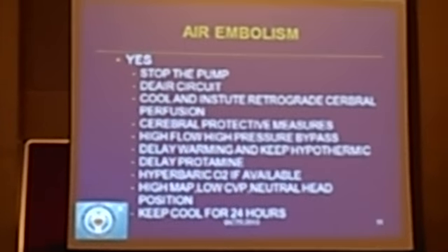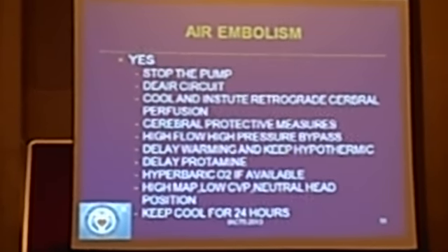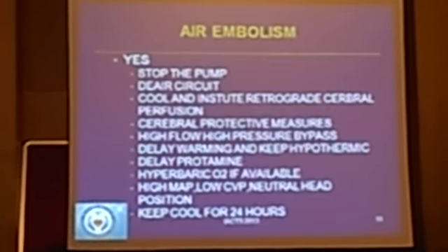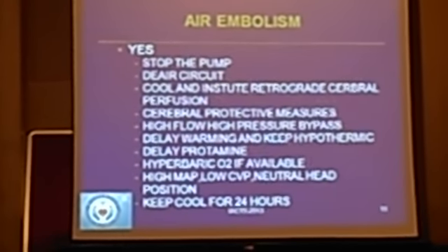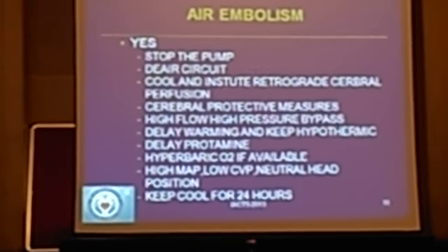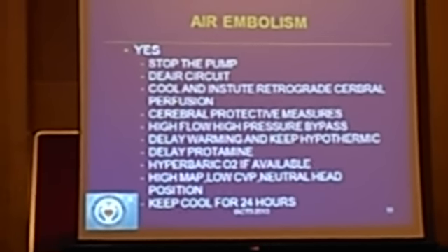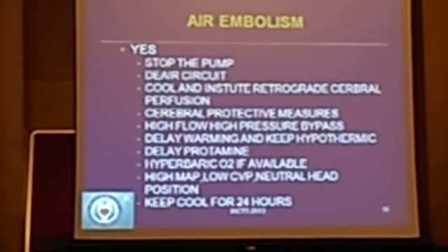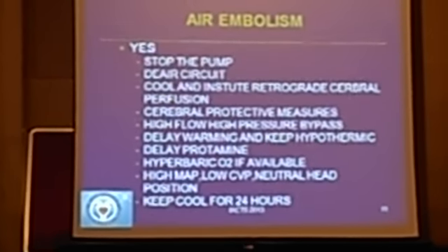Then once you reinstitute bypass, please have a high flow, high pressure. You can even give adrenaline. The idea is to ram the air to the most distal point. First try to get the air out. But once you have done whatever you can, try to ram it as distally as possible, so that if you have an infarction, you have the smallest possible infarction.